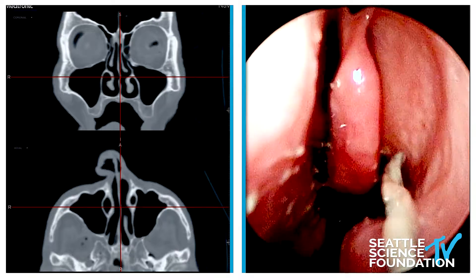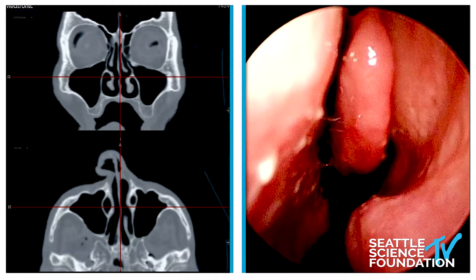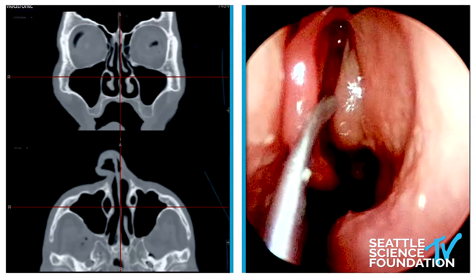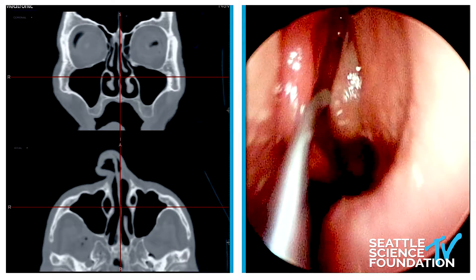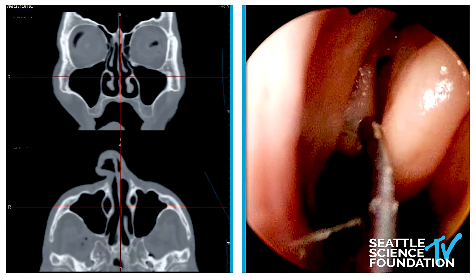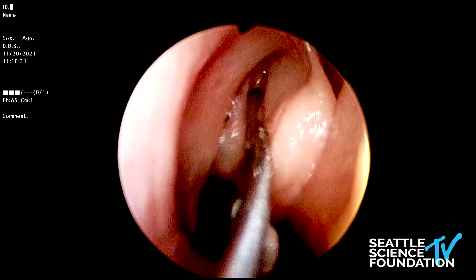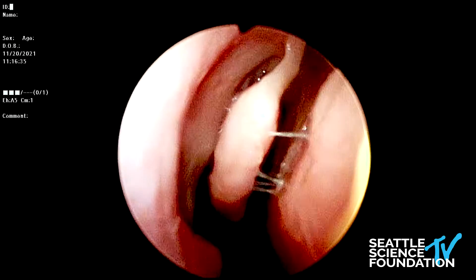If I'm doing this in clinic, I'm going to do the sphenoid dilation first, then switch to the frontal sinus, and we're going to medialize that. Once you know you can medialize that middle turbinate, you're going to have a very easy procedure. If the patient doesn't tolerate this, you know you need a little bit more anesthesia.